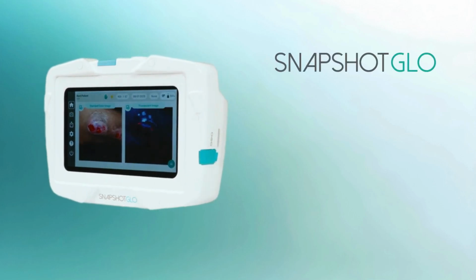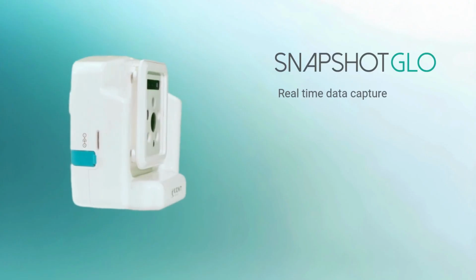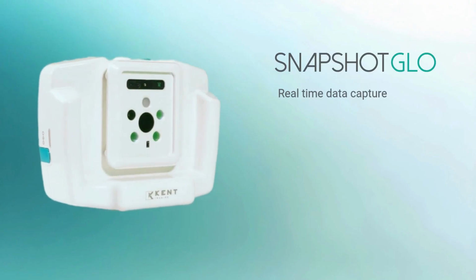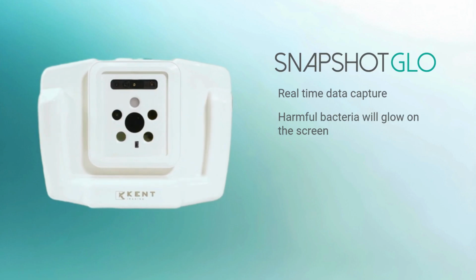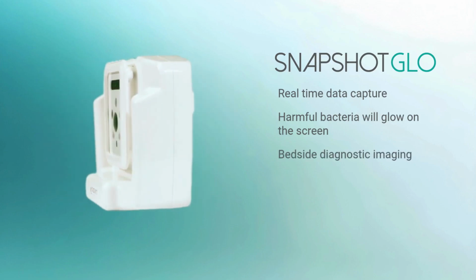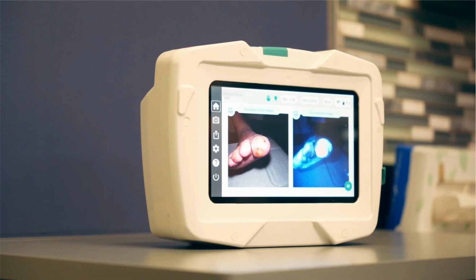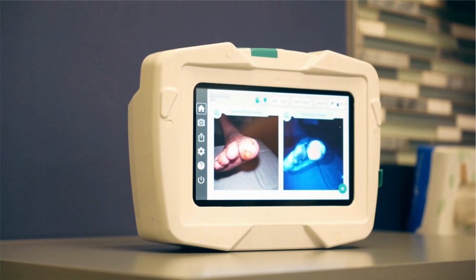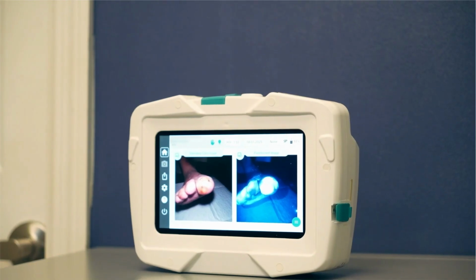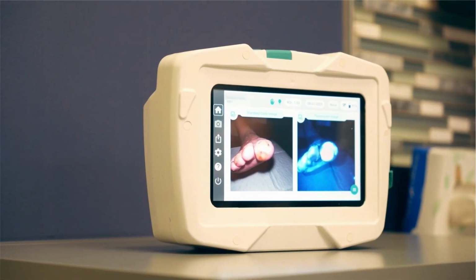SnapshotGLO is a powerful diagnostic imaging device. Clinicians can capture data by taking an image, just like a camera, and the results will show high bacterial loads as a glow on the screen. The device can be used at the bedside. It captures both a clinical image and bacteria image simultaneously and can help direct targeted patient treatments, ultimately improving patient outcomes while saving time and cost.